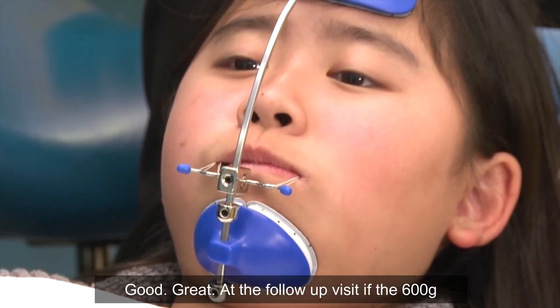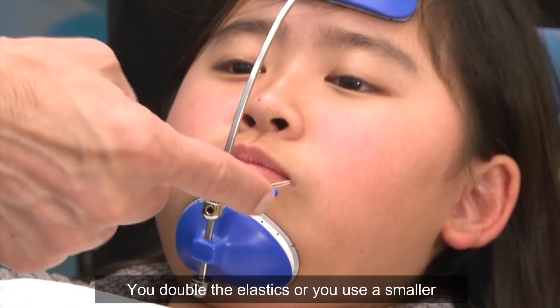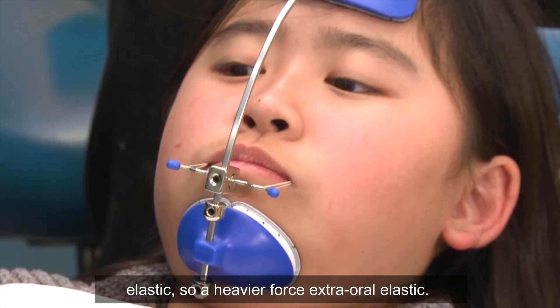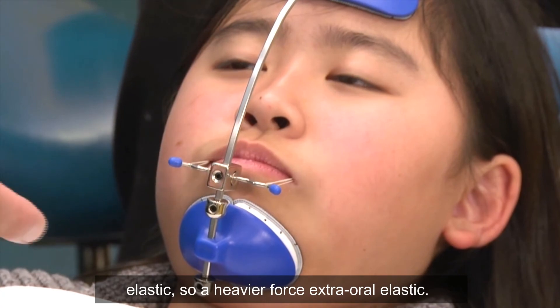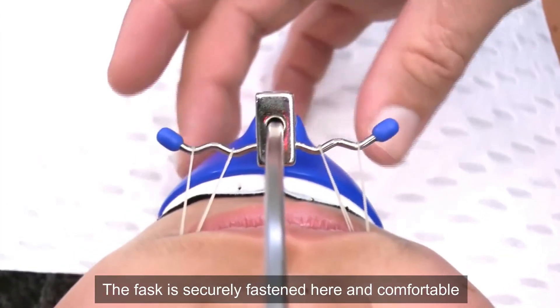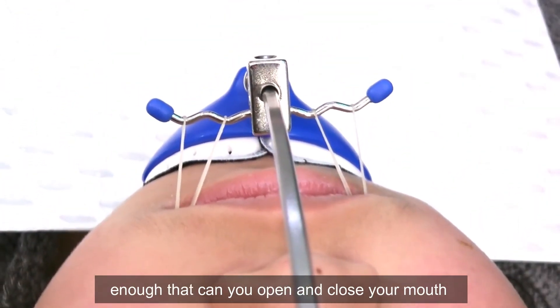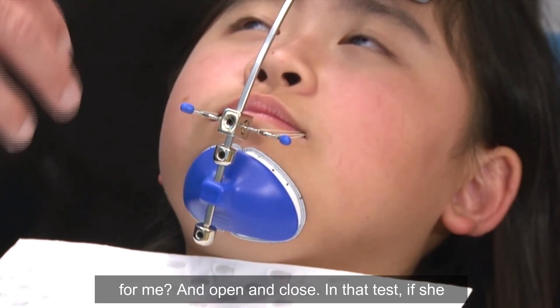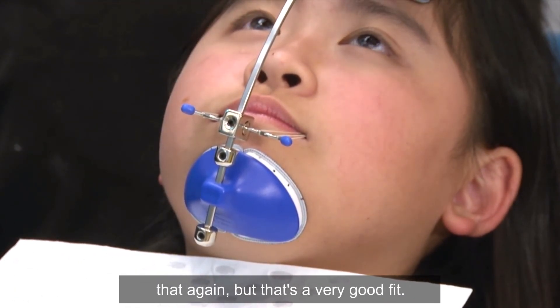At the follow-up visit, if the 600 grams is dropping down you have two choices: double the elastics, or use a smaller elastic — a heavier force extra-oral elastic. The mask is securely fastened and comfortable. Can you open and close your mouth for me? In that test, if she opens and the mask slides down, we need to adjust again — but that's a very good fit.